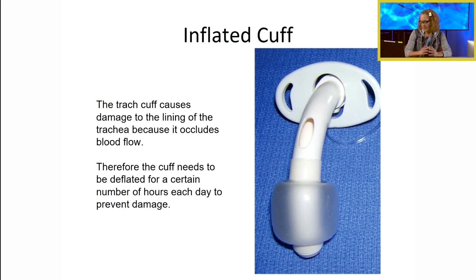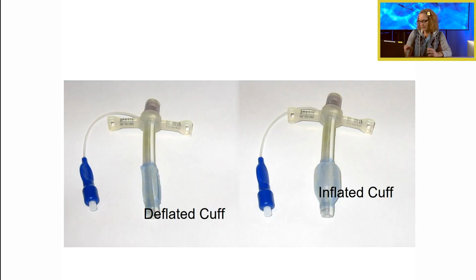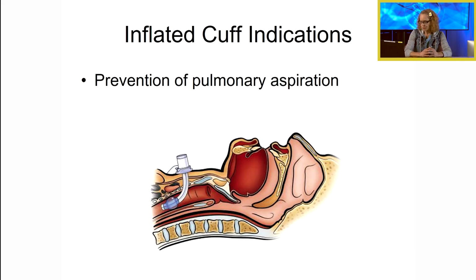So again, it's stated here in this slide that it will cause damage, and the cuff does need to be deflated for a certain number of hours to prevent that damage to the tracheal lining. So in this image, we can see both an inflated cuff and a deflated cuff, right? We're going to talk a little bit more about the parts as well moving forward here.